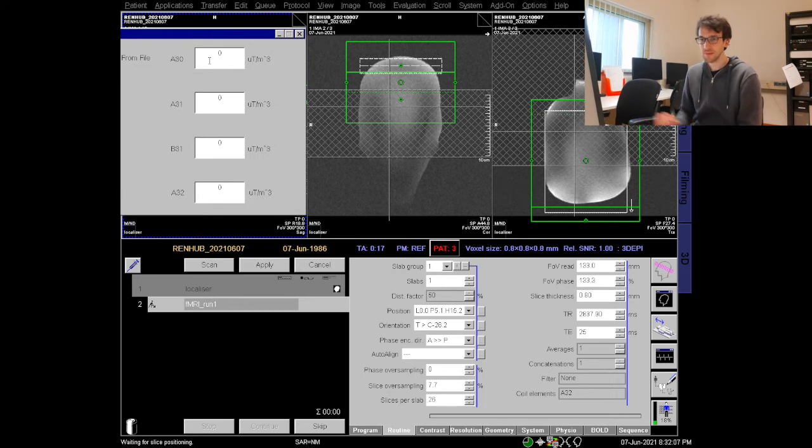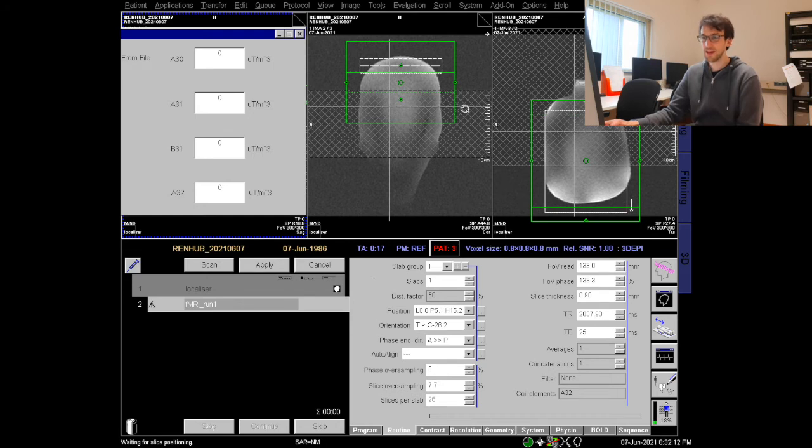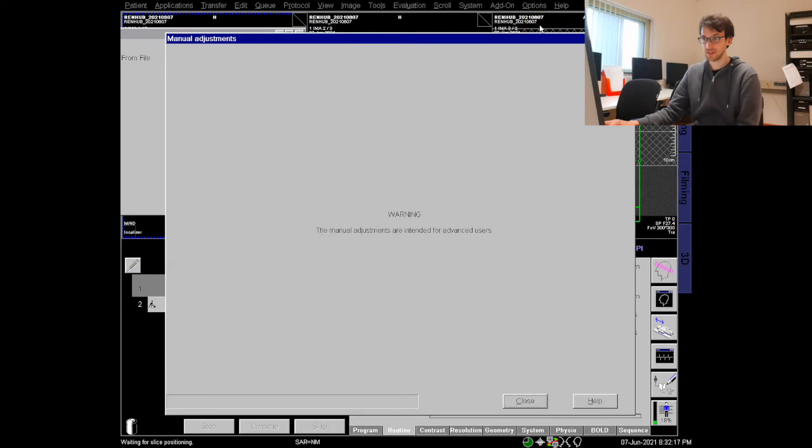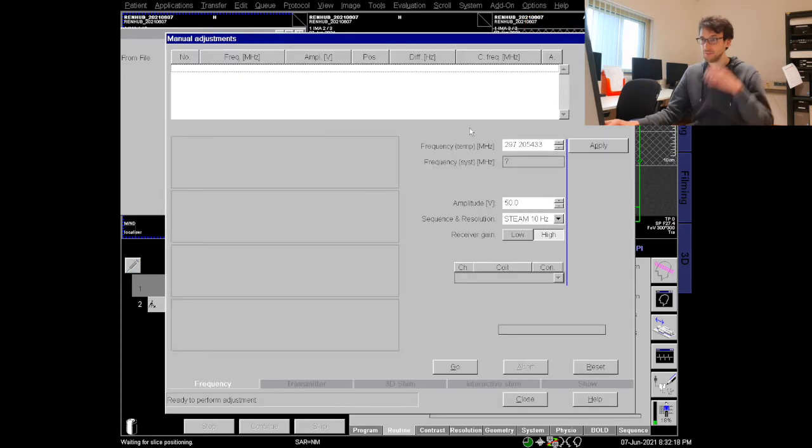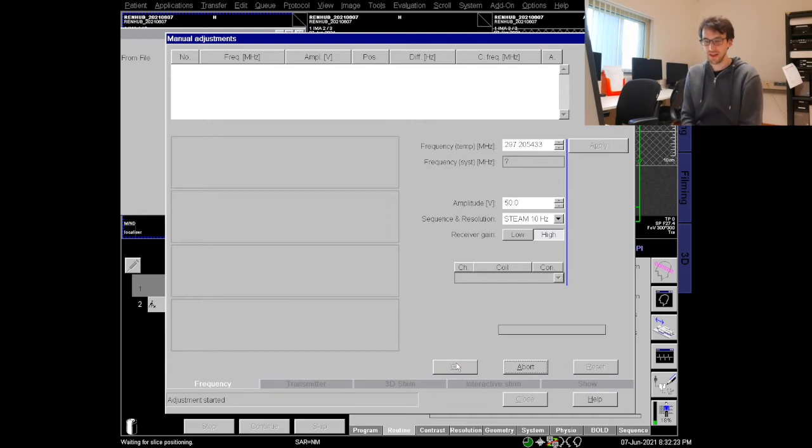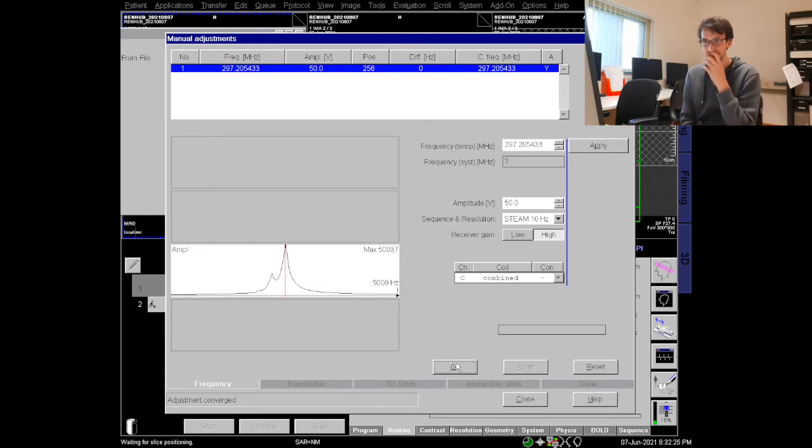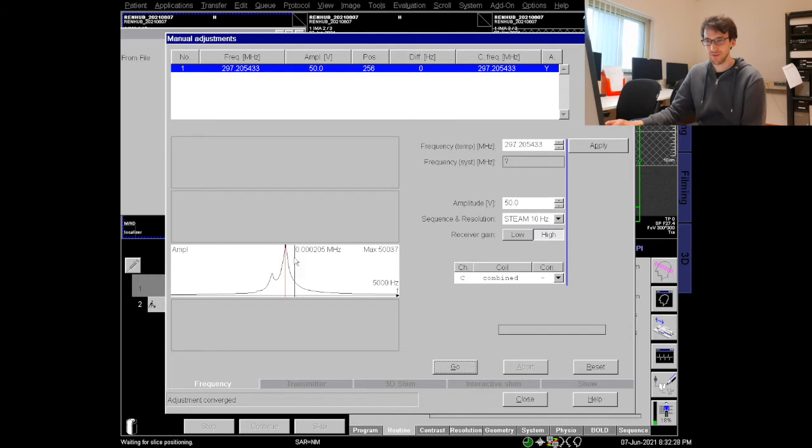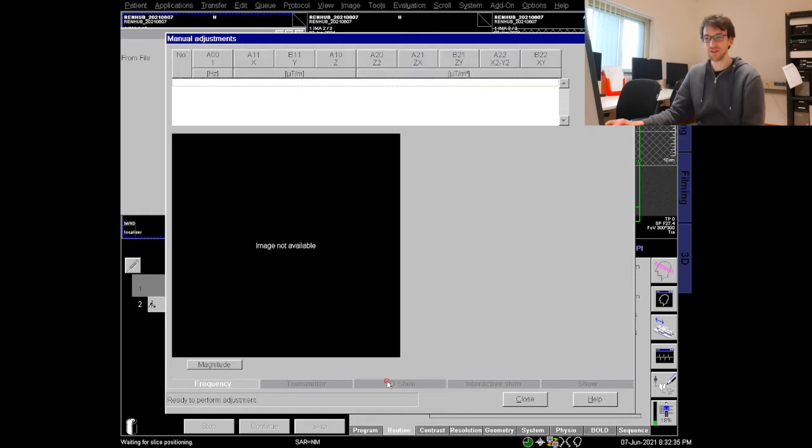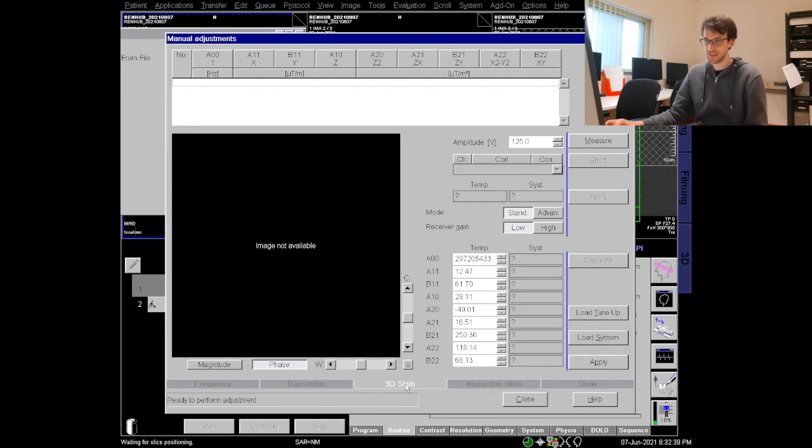Now we can start with the shimming procedure and first get a field map. We do that again with the option adjustments and before we can do a field map we want to have first a frequency. So I hit go and it will start to give me a frequency spectrum and we have a peak and it converged. This means that we have a yes over there so everything is good and we can go to the 3D shim. Not to be confused with the third order shim, this is a 3D shim which gives us the shim currents up to second order.